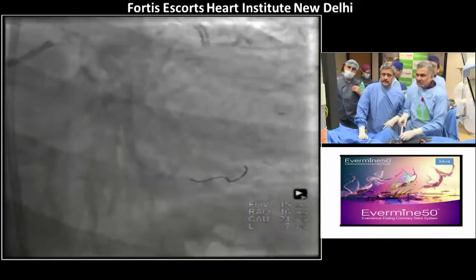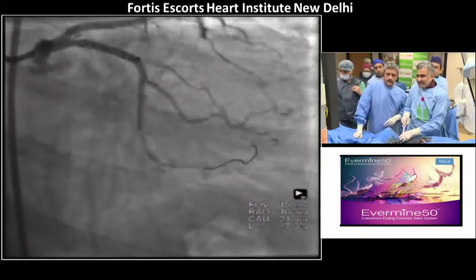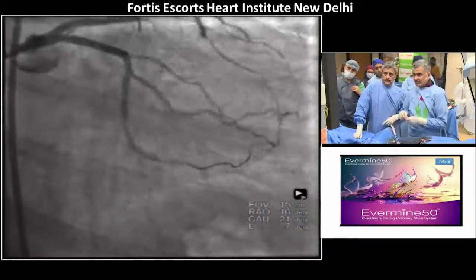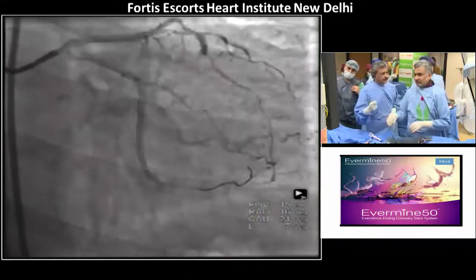That's a haziness there. So you think that's a little tissue prolapse still over there? Well, you'll have to look by IVUS, this is the only area that we are concerned. Yes. So first we'll do a 2.5 with this stent and then put in an IVUS.